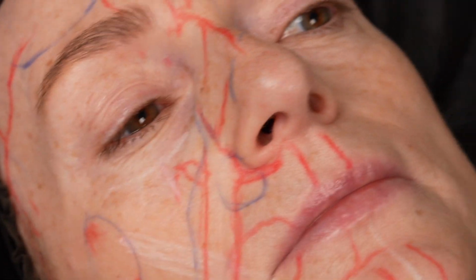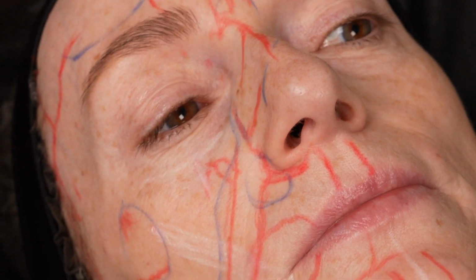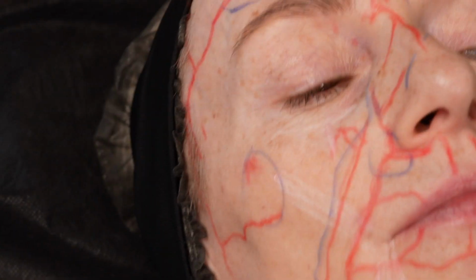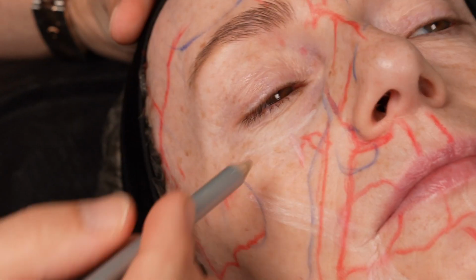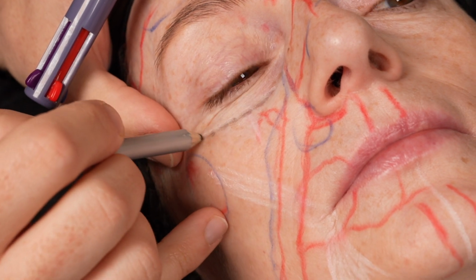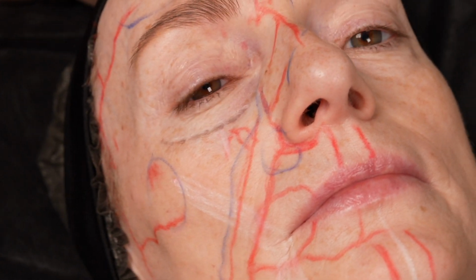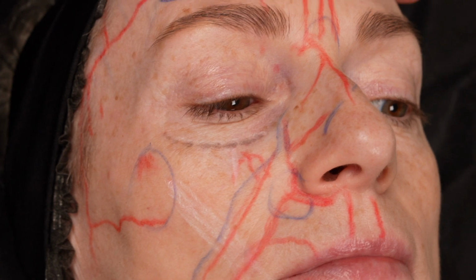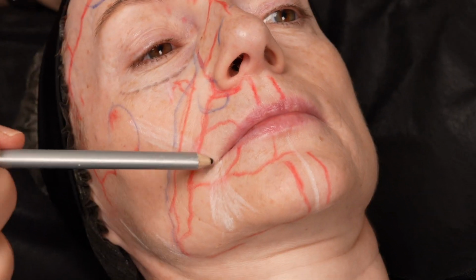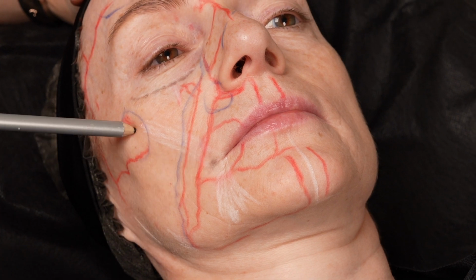So let's say how I find my deep fat pads on the mid-face. Let's see. I told you this is my orbital rim. Okay, so my first drawing, I can say from the commissure, the modiolus, to the zygoma.